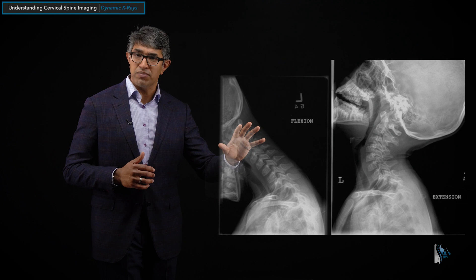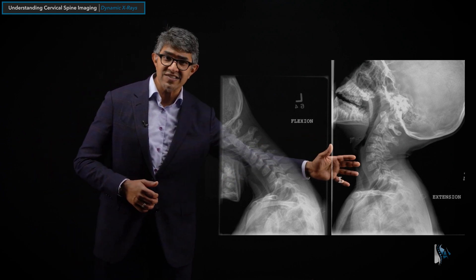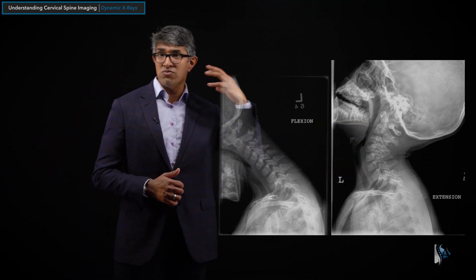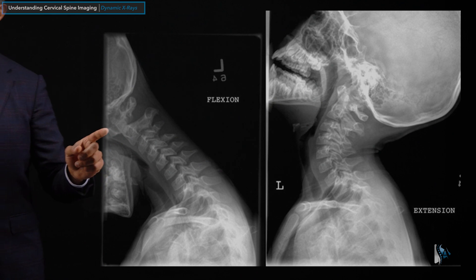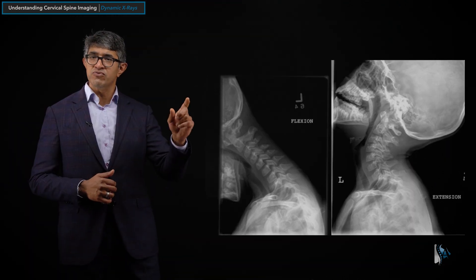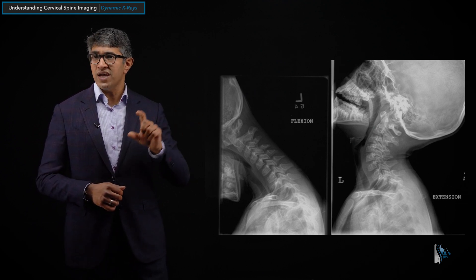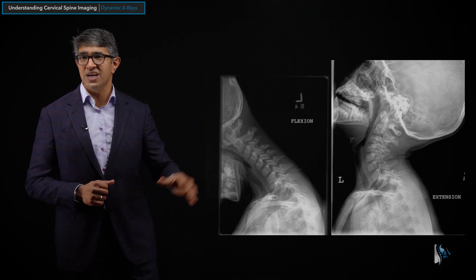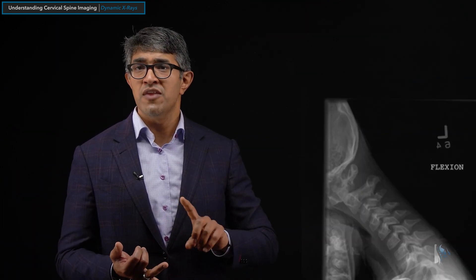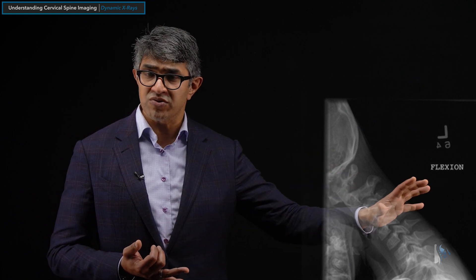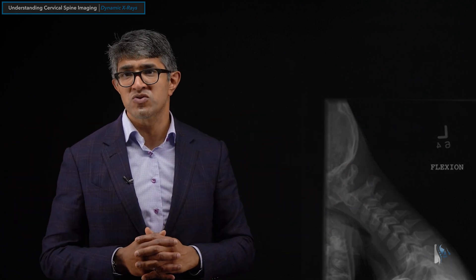This next picture gives you a sense of some pathology. Here you can see this person's leaning all the way forward — excellent range of motion — and all the way backwards. But if you really pay close attention, this person came in with really bad neck pain and shooting pain at the back of their head. They have nice alignment when they lean back, but when they lean forward, you can see a gap that forms — probably a four or five millimeter gap between C1 and C2. That is considered cervical instability, and you can't capture something like that on static imaging. That is the power of dynamic x-rays — showing range of motion and excluding instability.